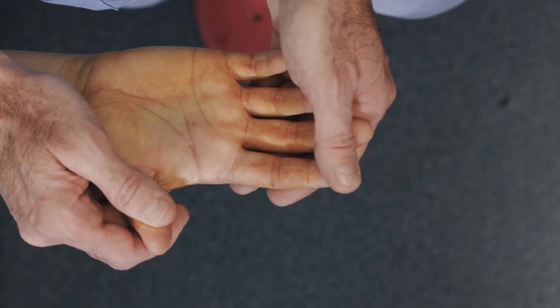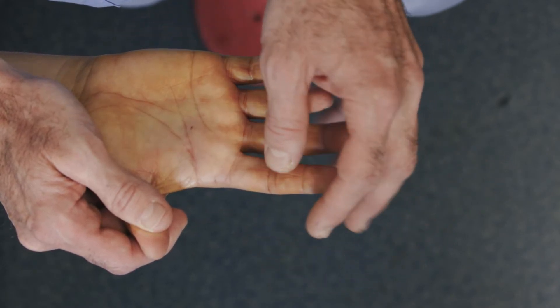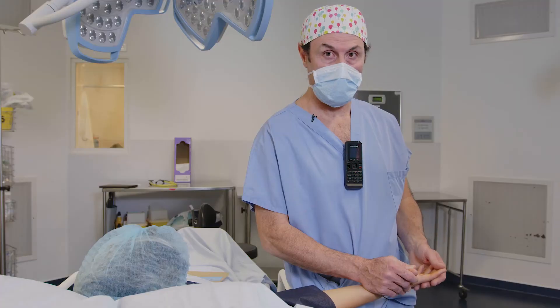It's okay. Five minutes after injection, we can see here that the skin became white, whiter than the other parts of the skin. So we have to wait 30 minutes before surgery.